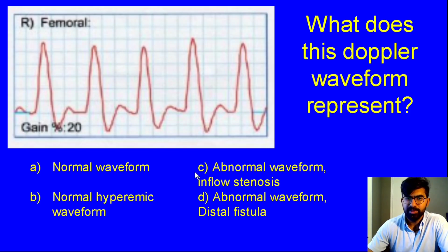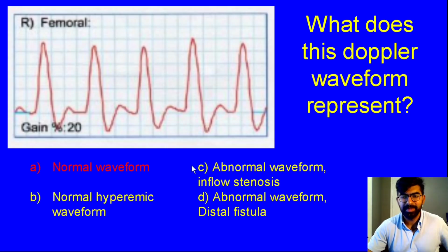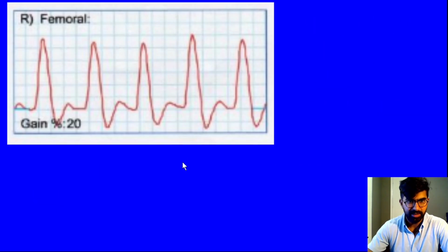And most of everyone here knows that this is indeed a normal waveform. But what we're going to focus on specifically is what really makes this a normal waveform. So we're going to, at this point, acquire the tools that are going to help us interpret the rest of this session, okay? So let's break this waveform down.